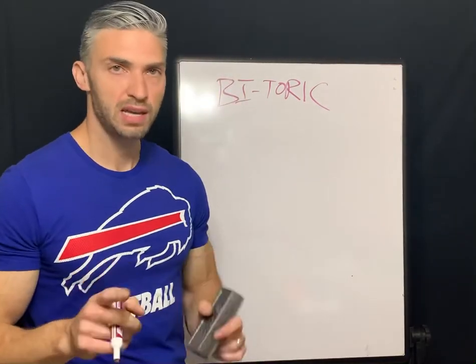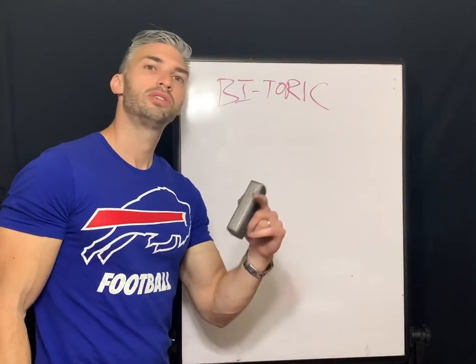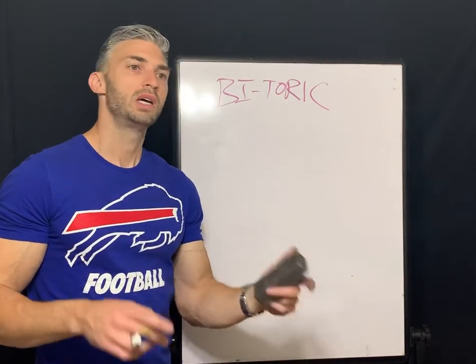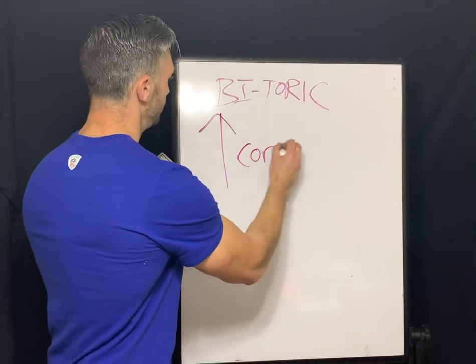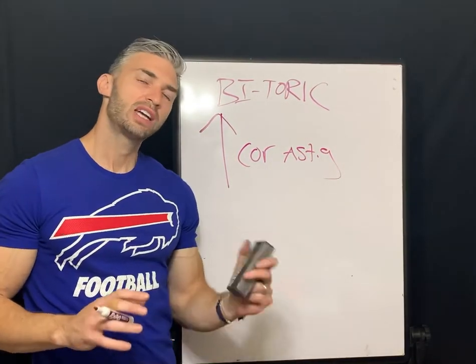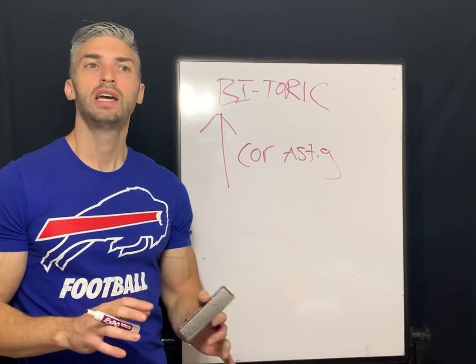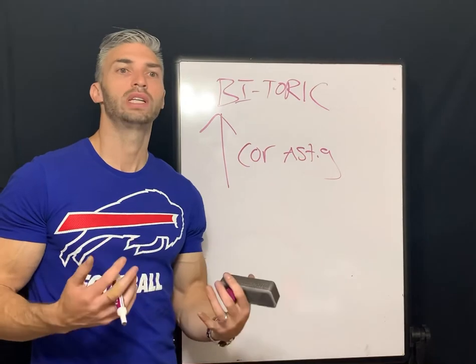Your clue on these lenses, like we've had the other clues, for back toric is 2/3 corneal to total astigmatism. Front toric, we're going to do minimal corneal astigmatism, a lot more residual astigmatism. So your clue with the Bi-Toric, just think high corneal astigmatism. High corneal astigmatism, check it against the 2/3 rule. It doesn't have to be exact, but if it's not super close, then you're probably going to be using a Bi-Toric lens if the corneal astigmatism looks really high.